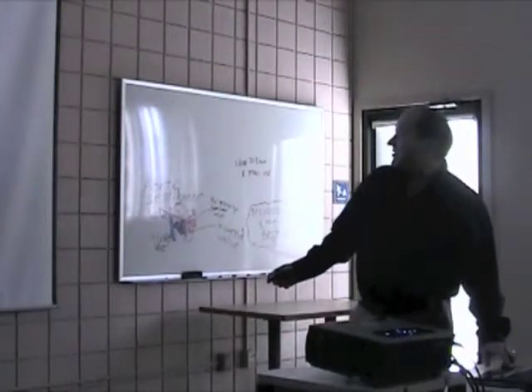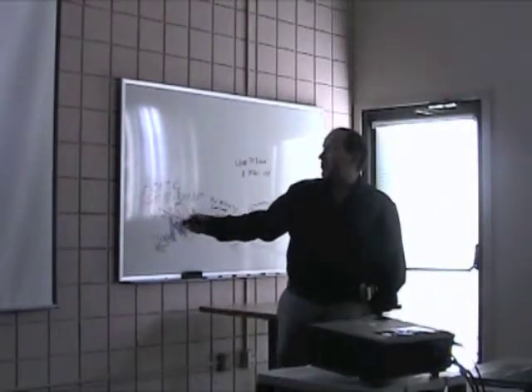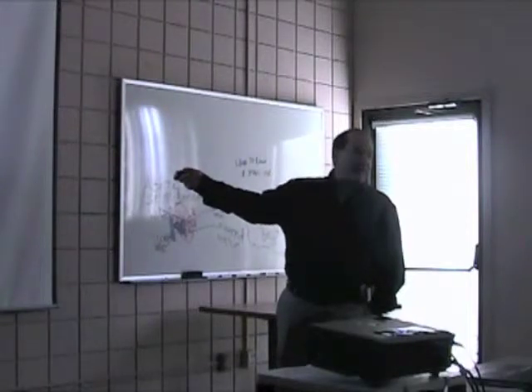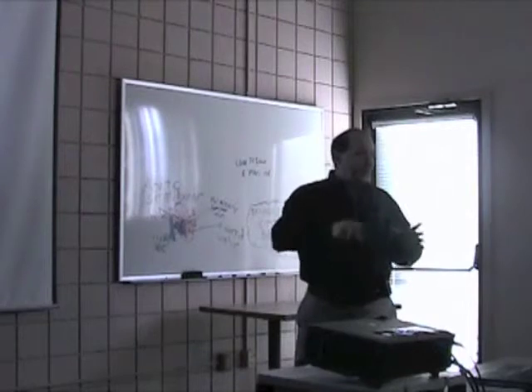I don't know if I can pause this. It's a very large aorta, and this is the surgeon cutting the aorta open. This is looking down inside the valve, and this is what we typically see. These are the 3 leaflets of the valve. In this patient, the valve's not so bad. It was mainly the aortic aneurysm, or the enlargement of the aorta, that they're replacing.